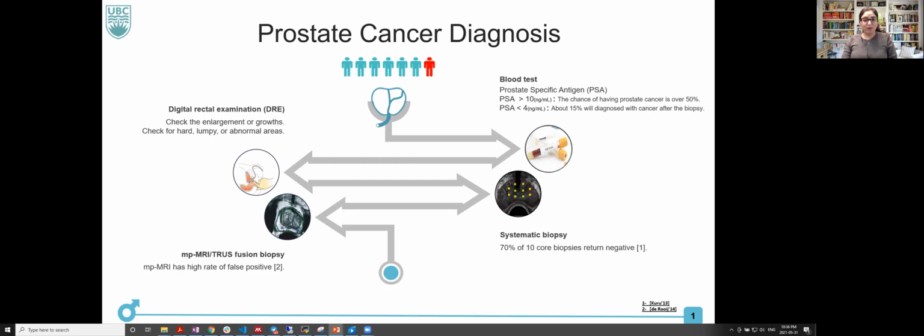This means that the biopsies is still required with a suspicious mp-MRI. In addition, registration of 3D transrectal ultrasound to mp-MRI is a complex task, and it fails to fully account for patient motion or organ deformation occurring during the biopsy.